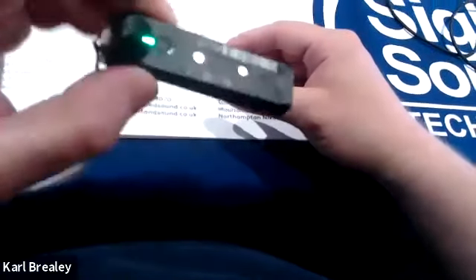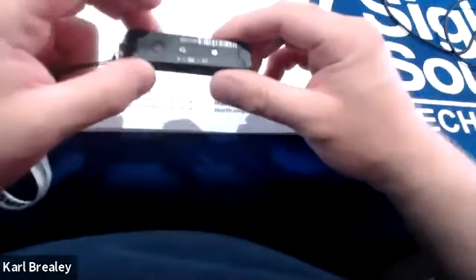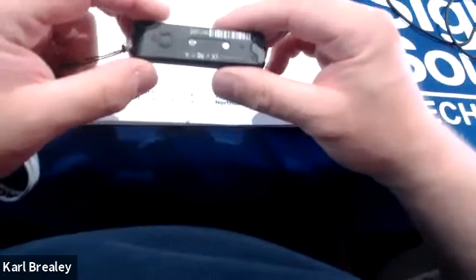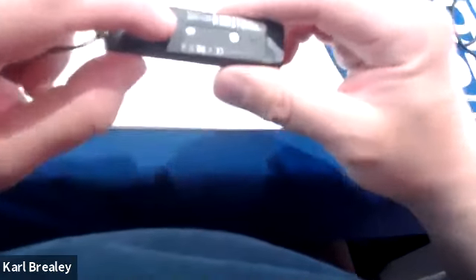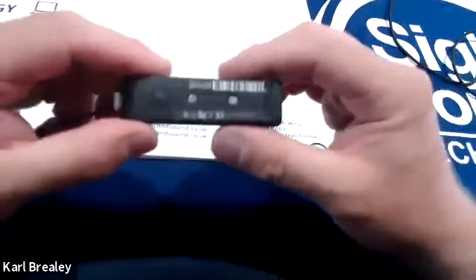Suspending. Press again to shut down. I'll just wait for it to suspend, and I'll release it from its suspension, and you can hear what it says when you actually turn it on. Suspended. So this is what happens when you turn it on. Waking up. Battery is 94% charged. So basically what it's doing is it's turning on, it's giving you an update, and it's telling you what is there. Now, when that's turned on from the beginning, what it will also do is tell you if it's connected to your Wi-Fi, but we'll go through that again in a moment. So there's your power options.